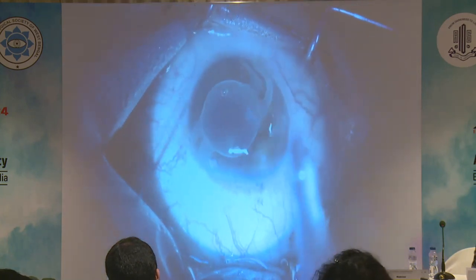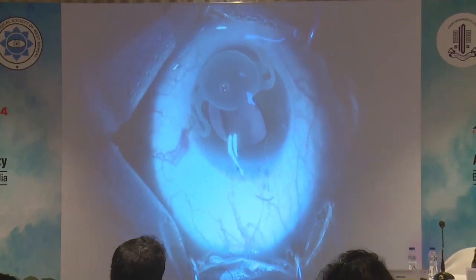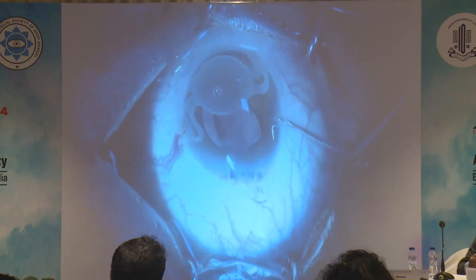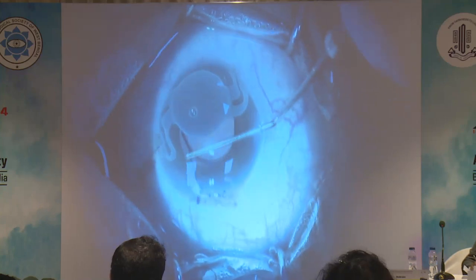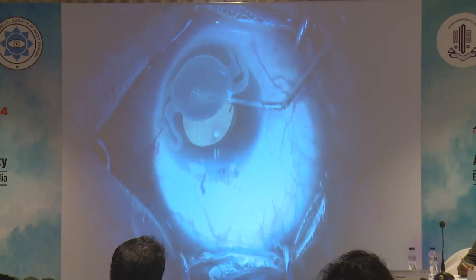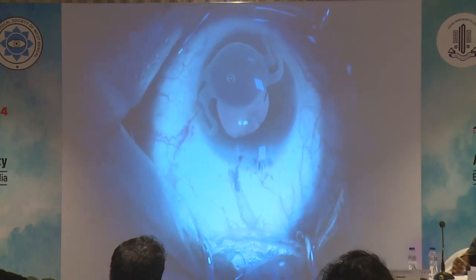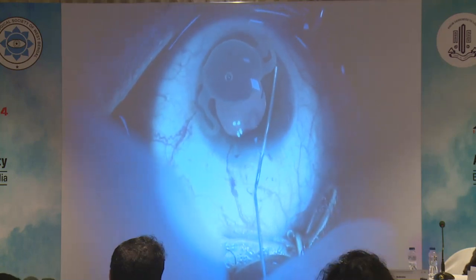Then I take a 3-piece IOL and dial it, and initially place it above the iris. I inject dispersive viscoelastic again above the opacified IOL.